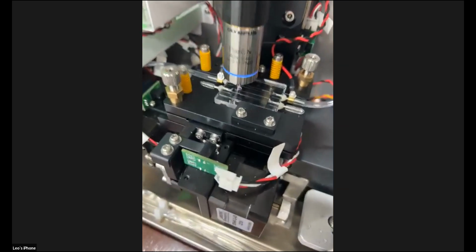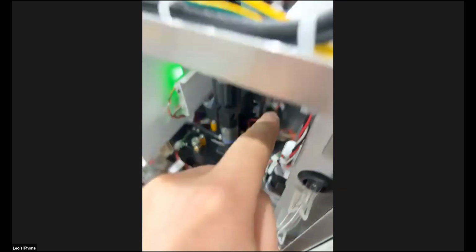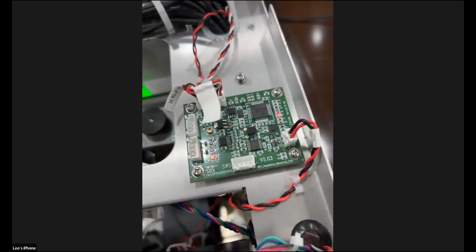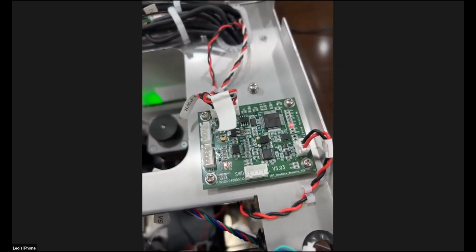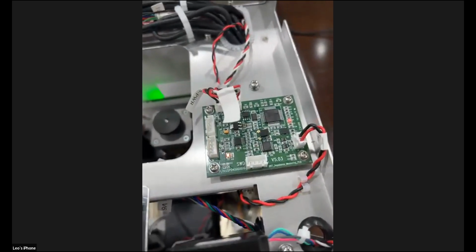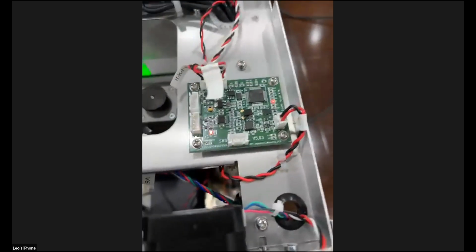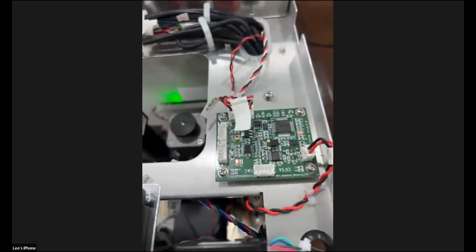And this connector will have a cable, and this cable is connected to this board, and this board is specially for testing the conductivity and osmotic pressure items. So this is very important, because this is for testing the physical items from our machine.